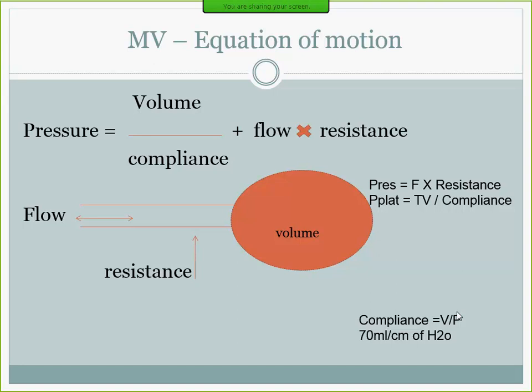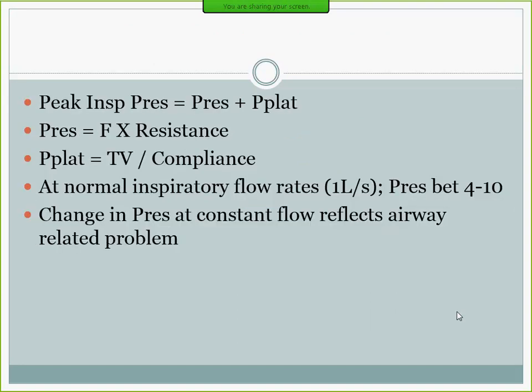So if a patient is intubated for an airway related problem like COPD or asthma, they will have a high resistive pressure but normal plateau pressure. A patient who is intubated for pulmonary edema or ARDS or pneumonia or something will have both high peak pressure and high plateau pressure, with no drop when you put in the inspiratory hold and stop the flow, because there was no change, right? And this is how, everything we just talked about summarizes the whole thing.